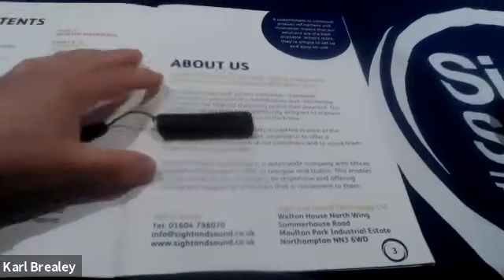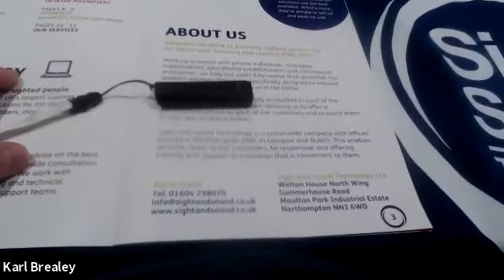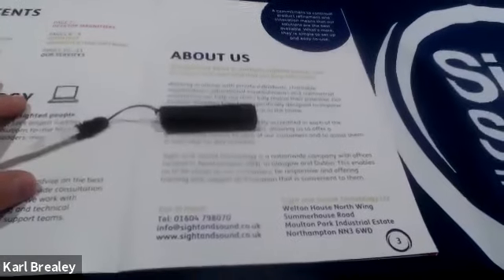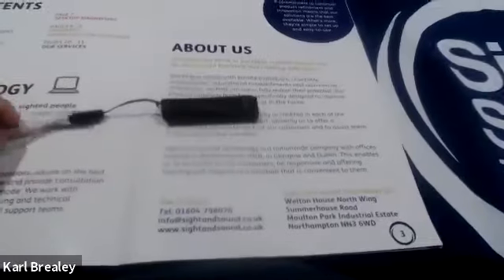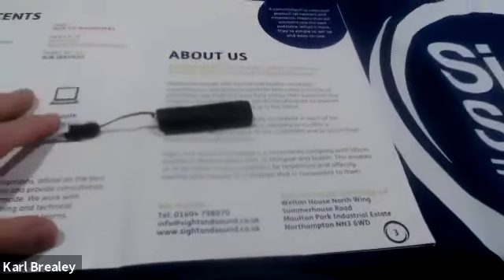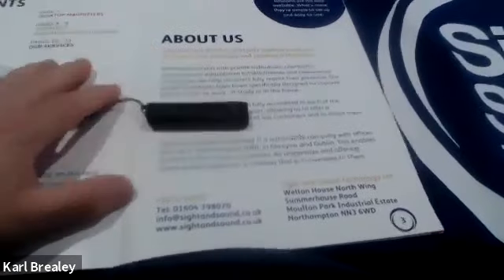Oh, but before, I remember you used to take the pictures, isn't it? Yeah, there is. I'm going to go through the My Eye functions in a moment where you can do the facial recognition and everything. You need the storage for that, no? It's still not storing photos, it's still doing it in code, so there's nothing really. They wouldn't hold up to 150 faces, but it's still not taking up a lot of the capacity. The majority of the capacity is for updates and everything else.